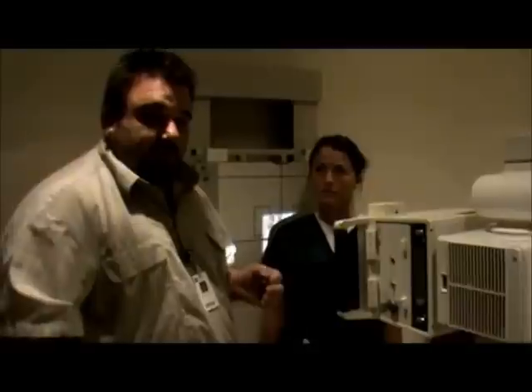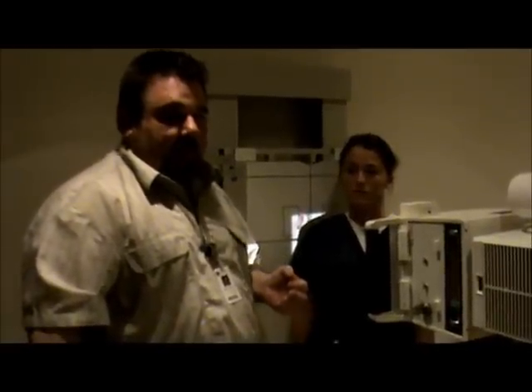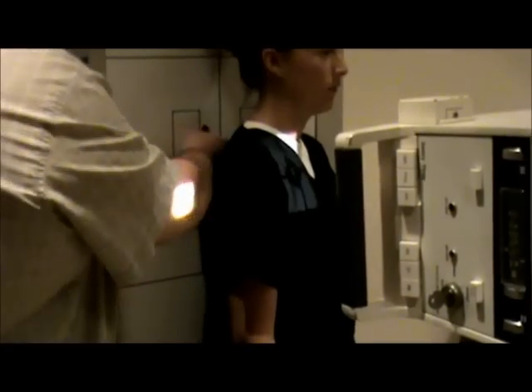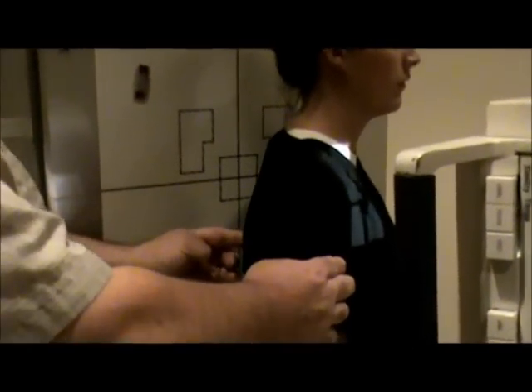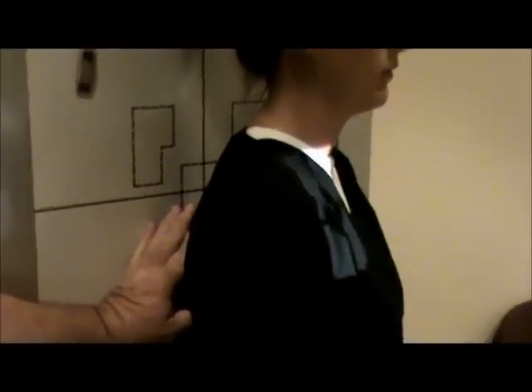The next view we're going to do is our Y-view. We're going to demonstrate both ways — there's an AP and a PA view you can do. We're going to take the patient and oblique them. Some people will place their fingers on the medial border of the scapula, spread them out, and then rotate the patient so that the fingers actually touch the bucky. That makes the border of the scapula perpendicular to the IR.